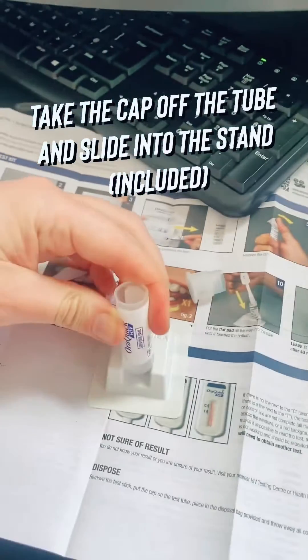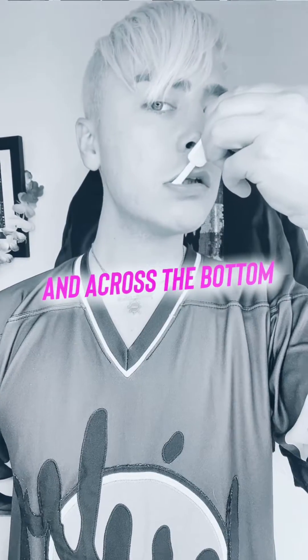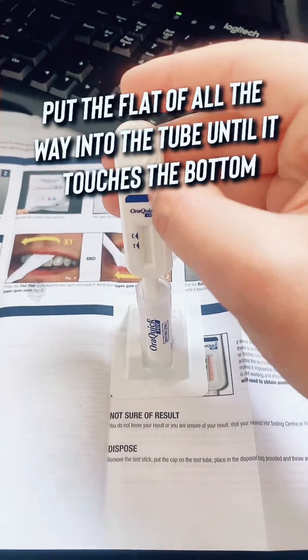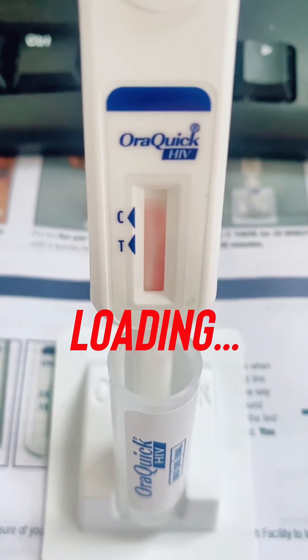Pop the cap off of the test tube and place that into the stand which comes included. Press firmly against your gum at the top and swipe across once, then repeat at the bottom. Put it flat all the way into the tube till it touches the bottom and rests comfortably. You need to let it load for 20 minutes until you get your result.